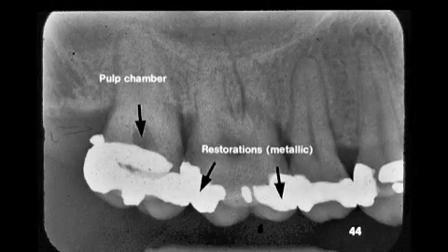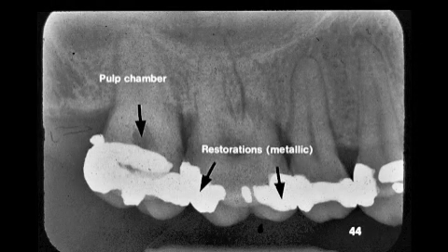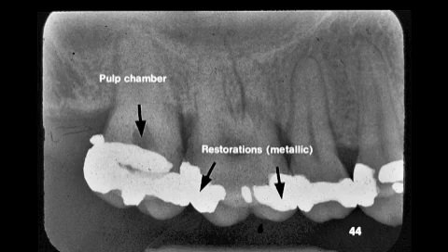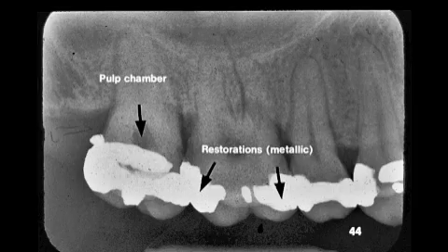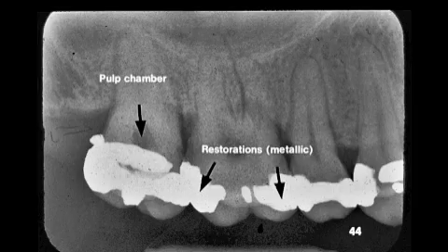The arrow to your left points to the pulp chamber, which is radiolucent. The areas that the other arrows point to are amalgam, radiopaque metal fillings in the tooth structure.